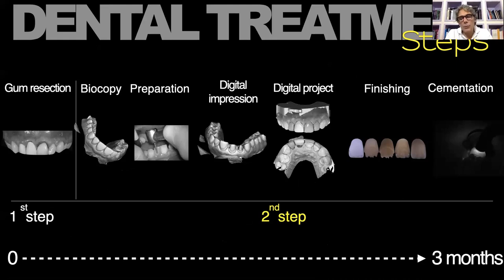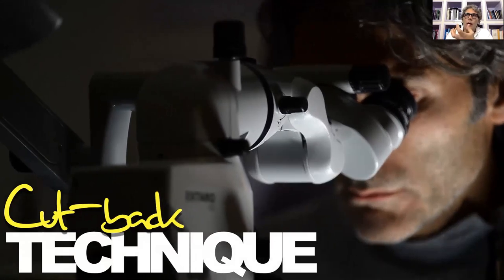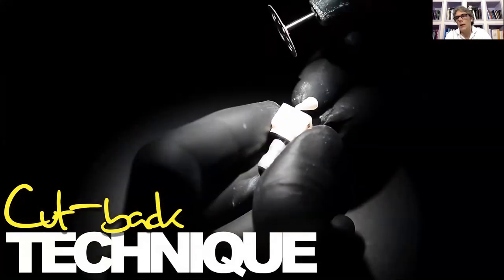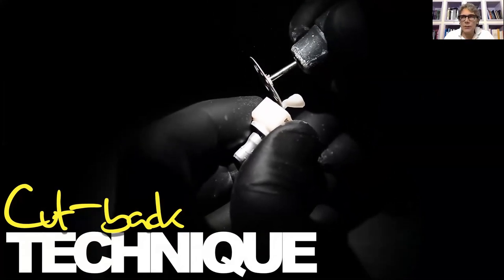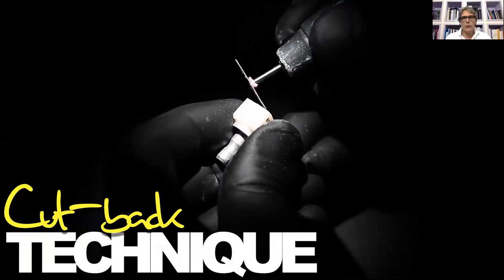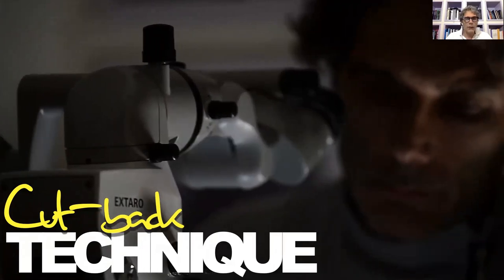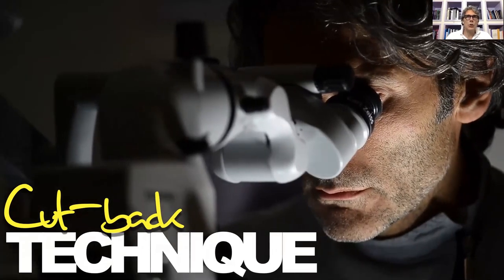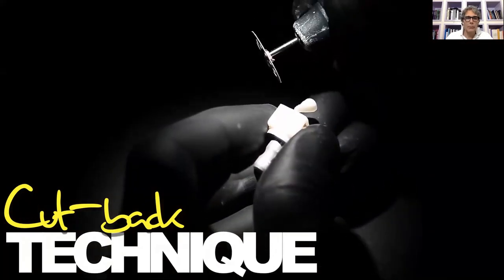So after the project and after milling, at the beginning of the second day, I have to finalize the restoration after its milling. In this regard, we can apply three different techniques that I inserted in my protocol of work when I have to manage the frontal teeth. I use a polishing technique, a staining technique, or a cutback technique.